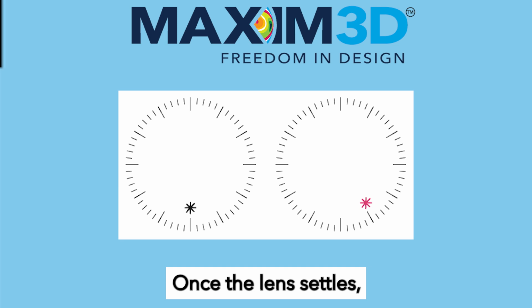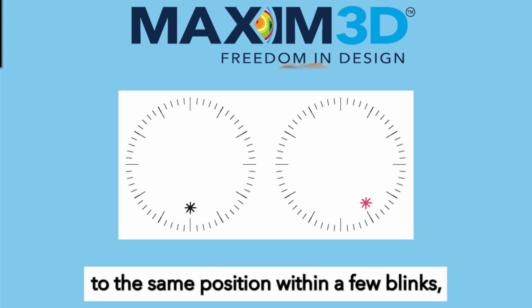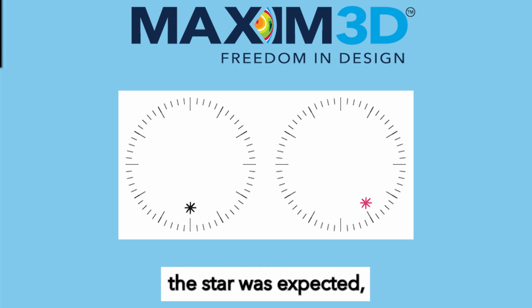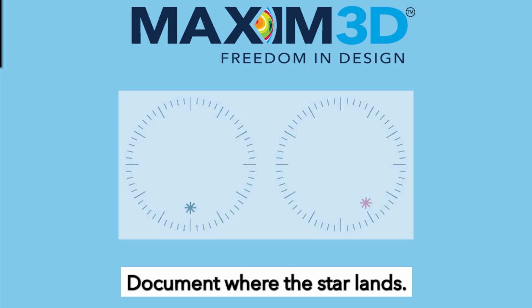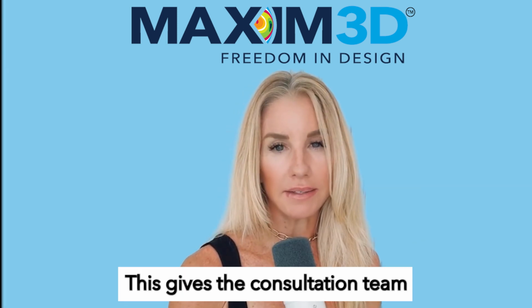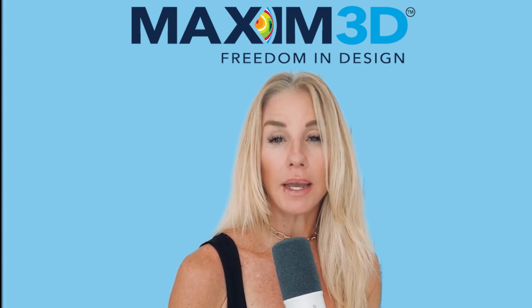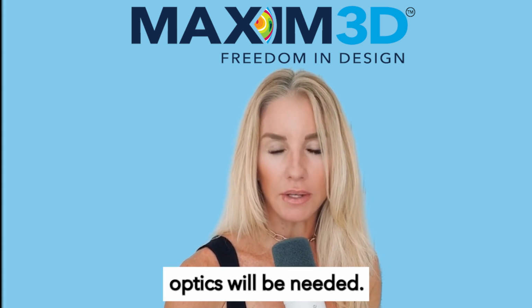Once the lens settles, gently rotate it about 30 degrees. If it returns to the same position within a few blinks, you've got a stable landing. It may not rotate to where the star was expected, but if it's consistent, that's what matters. Document where the star lands. This gives the consultation team a guide to how the lens aligns rotationally, especially if doing zone-specific changes or if front surface optics will be needed.